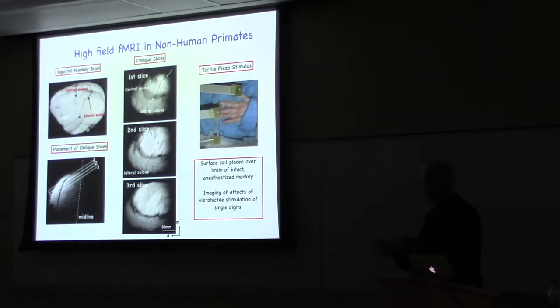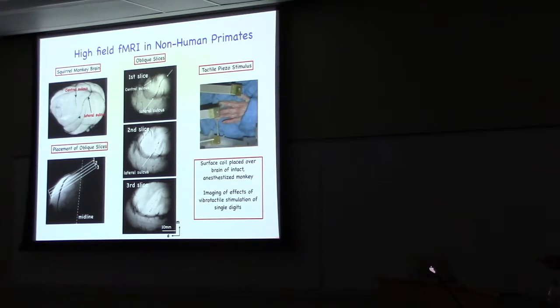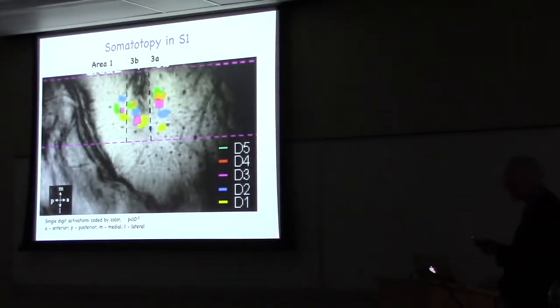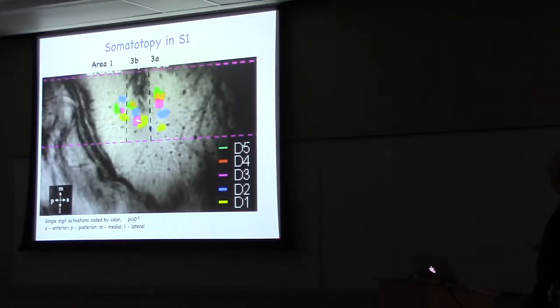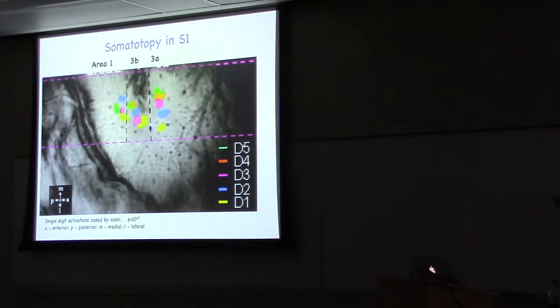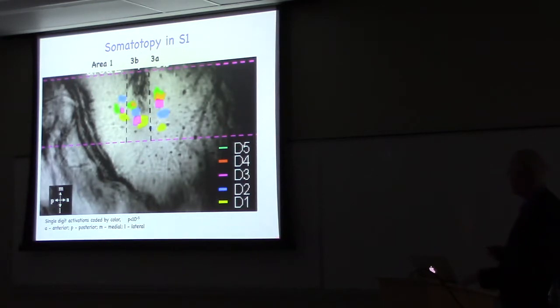So just an example of how that's actually used, and I showed this morning, but we work a lot with primates. So this is a squirrel monkey brain. We take slices through the cortex, and these are 3 parallel slices. We stimulate the digits with these little piezoelectric vibrators, so it's a very subtle stimulation. When you do that, you can see the somatotopy in the brain, so these are the digits 1 to 5 in 3 areas of cortex with a resolution of about 0.5 millimeter, corresponding to those BOLD signal changes, from the fact that when you stimulate the brain, you wash out some of the deoxyhemoglobin, and the brain becomes more uniform, there's less magnetic non-uniformity, and you get a signal increase of about 1% or so.